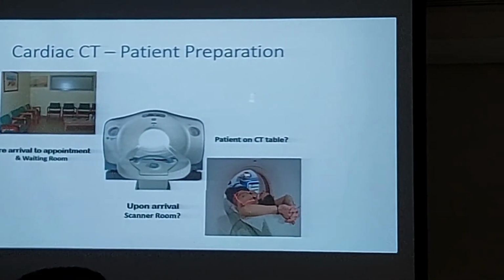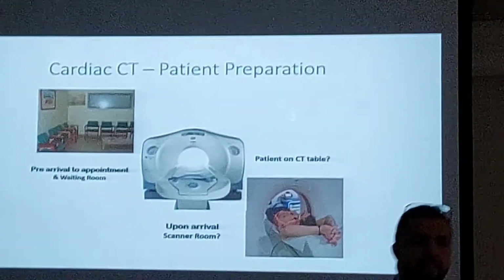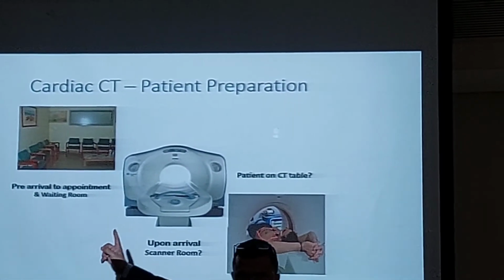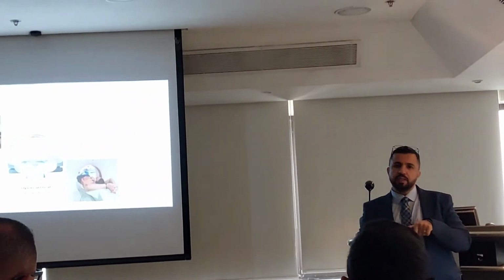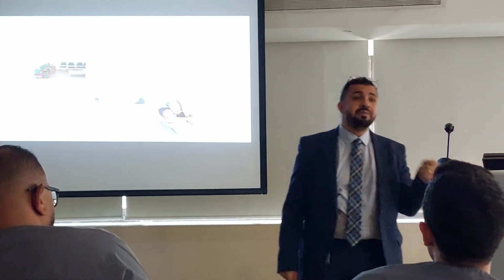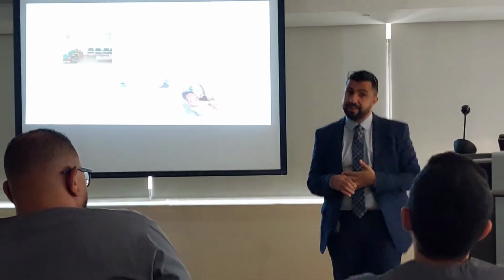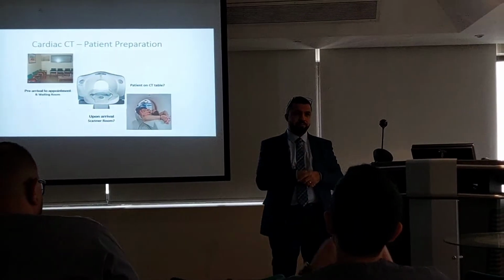Now, if I ask you, where do you think we should start preparing the patient? In the pre-arrival waiting room, in the arrival room, or on the table? Where will we start preparing the patient? Even before reception. That is correct. We will start preparing our patient the moment he comes to set an appointment, because we will give him preparation instructions. There are only a few procedures where we do that, and cardiac is actually the main one.